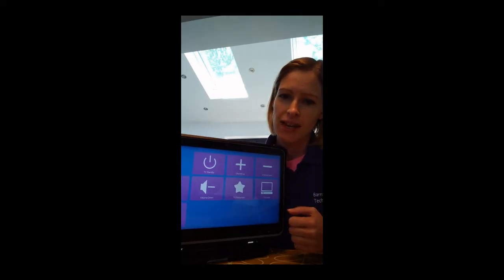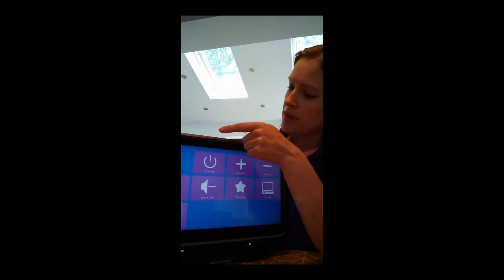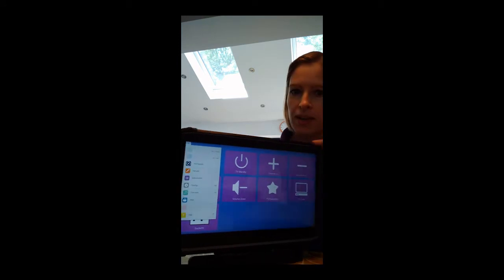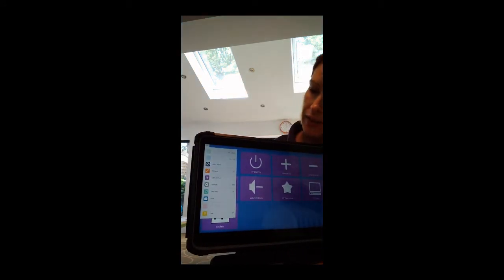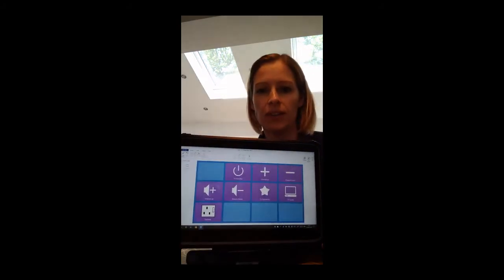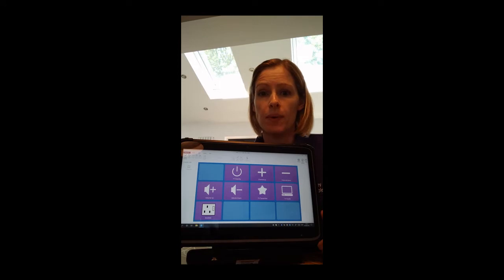Next you need your Grid Pad. Go up to the top of the screen and press anywhere along this top end of the screen. It will bring up the menu bar down the side and you need to click on the little orange symbol that says Edit Grid. That will take you into editing mode for the Grid 3 software, and that's where we need to be in order to set up your TV control with the device.